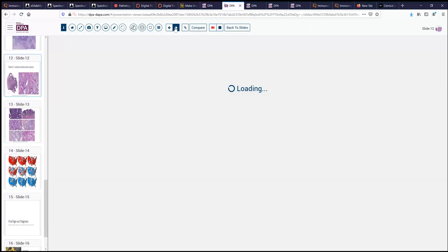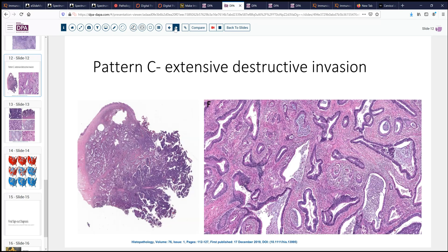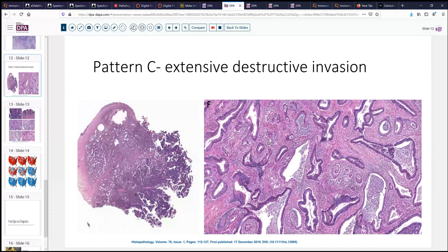Pattern C is the further extreme of what we saw with pattern B, where it's more diffuse. There's extensive destructive invasion, extensive single fragmented glands, angulation of the glands, and a pattern of stromal response and inflammation that is more extreme than pattern B. Although it's somewhat subjective to say limited versus extensive, usually that's not a huge problem because it's a fairly established feature.